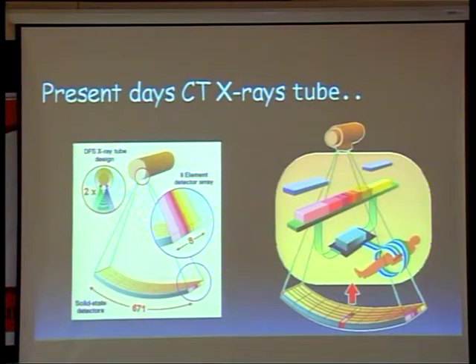The tubes have a graphite coating behind. It's a new technology we are using in our present CTs. As you can see in this tube, two rays are coming out from the same source. So it's like you are bombarding from 2 different sources, like 2 tubes working for you on one patient simultaneously. So you are actually taking out 2 doses, or 2 sets of rays, for one patient.